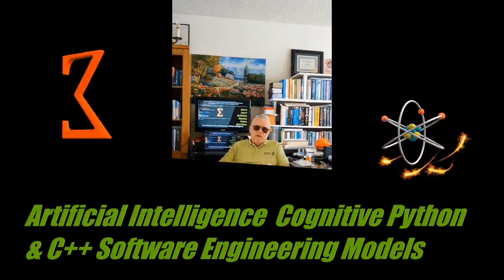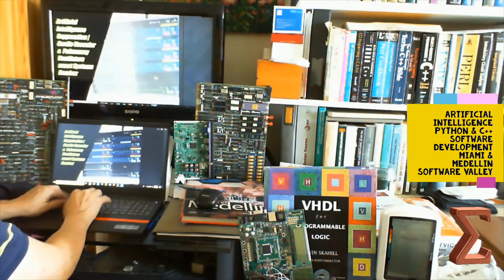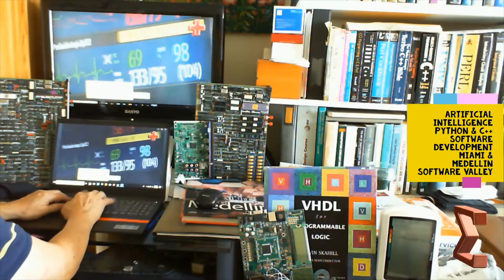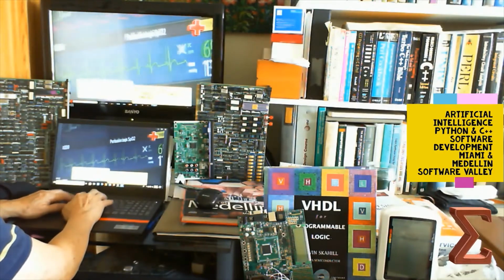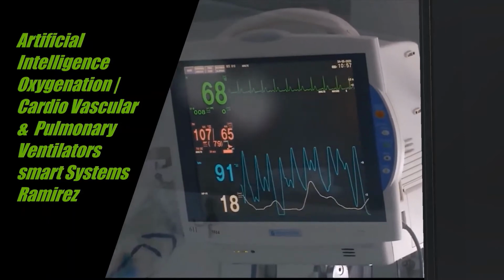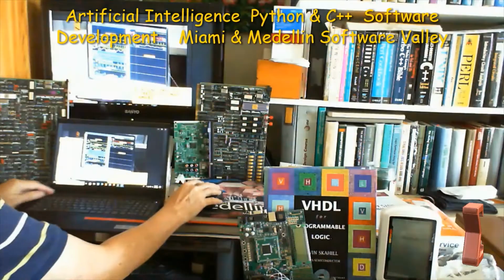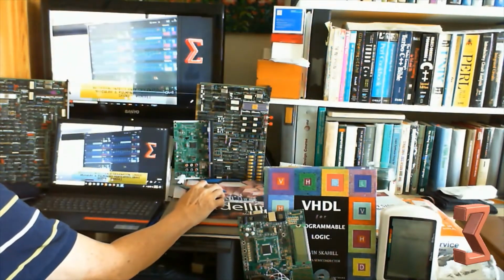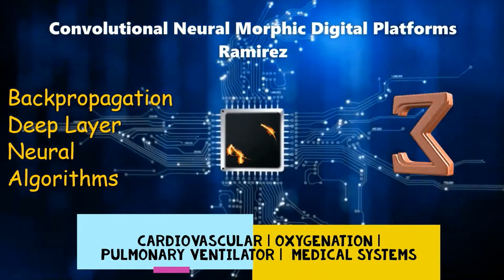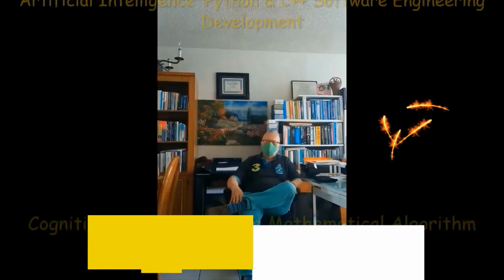The plethysmographic trace waveforms, which is oxygen saturation, that is SpO2, including heart rate data. The pulse oximetry system is used as a non-invasive method to measure arterial oxygen saturation in the blood stream.